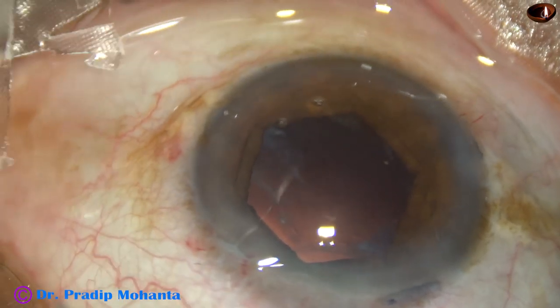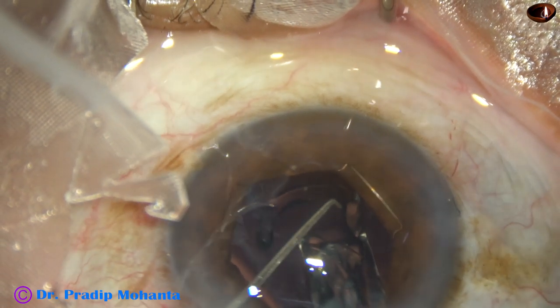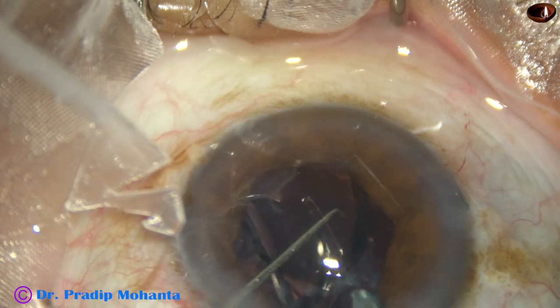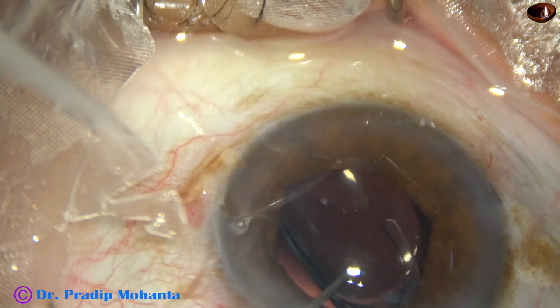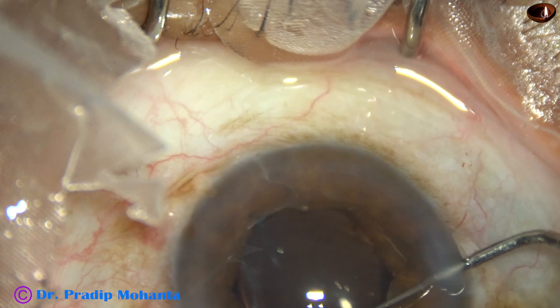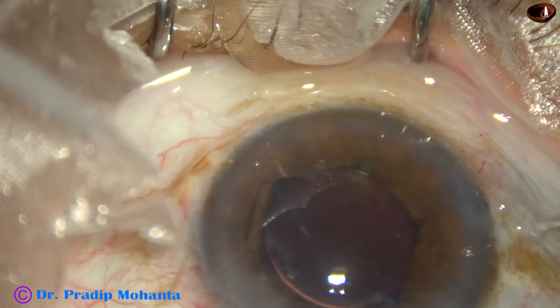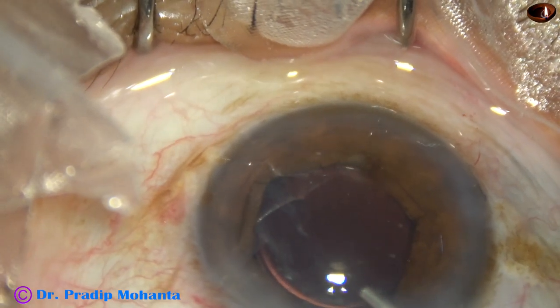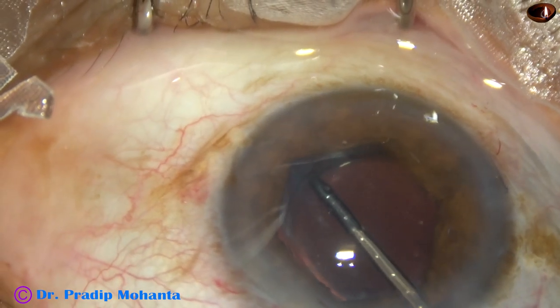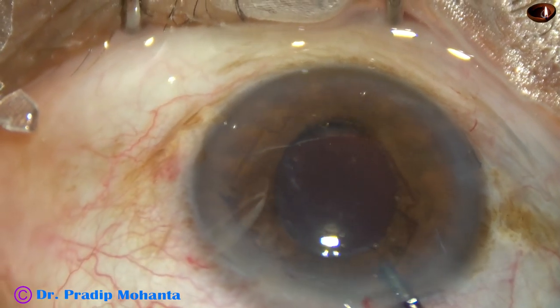Viscoelastic is injected to fill the anterior chamber nicely, and then a single-piece monofocal intraocular lens is implanted. This is an aspheric lens from J&J — it is the Tecnis 1. It's a beautiful lens with no glistenings; the lens remains clear. It's a time-tested, good lens. The lens is nicely placed in the capsular bag. Some more viscoelastic is injected, and now it is time to remove the B-Hex pupil expander. The device is held, untucked, and pulled out. No injector system is needed for application or removal of the B-Hex pupil expander device.